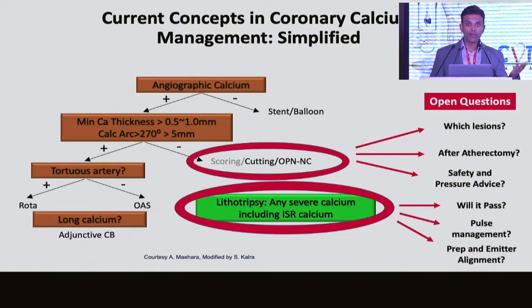What about how you prep the balloon? How perfect does the contrast prep have to be in an IVL to really get sound transfer? How does that differ from a cutting balloon, where the consequences of rupture are huge if you leave an atherotome behind? And what about cost? Particularly in the environments outside of the US where we're not made of money and we don't run an insurance-based program. So there's a lot of questions here, right?